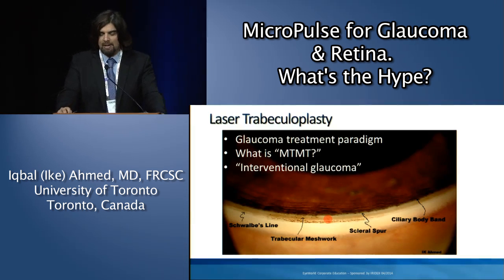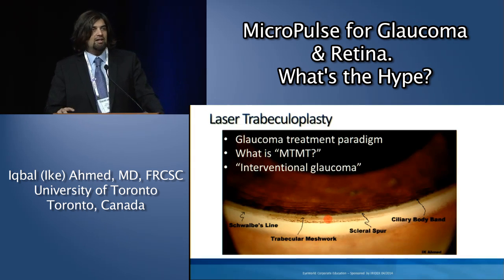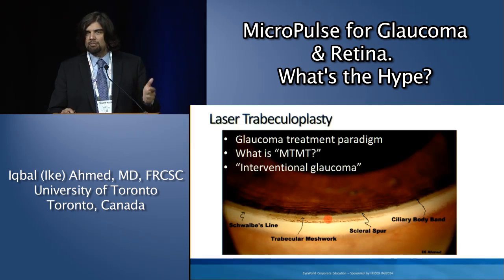And those of you who maybe had a chance, who stayed away from my bin course lecture, probably heard me talk about interventional glaucoma, right? Talk about how IOP is a surgical disease. And we've gone through the renaissance of the medical era into the renaissance of the interventional era. And I truly believe that using laser trabeculoplasty, drug delivery, and microinvasive glaucoma surgery are ways that we're going to be able to obviate some of the concerns we have with topical glaucoma therapy.